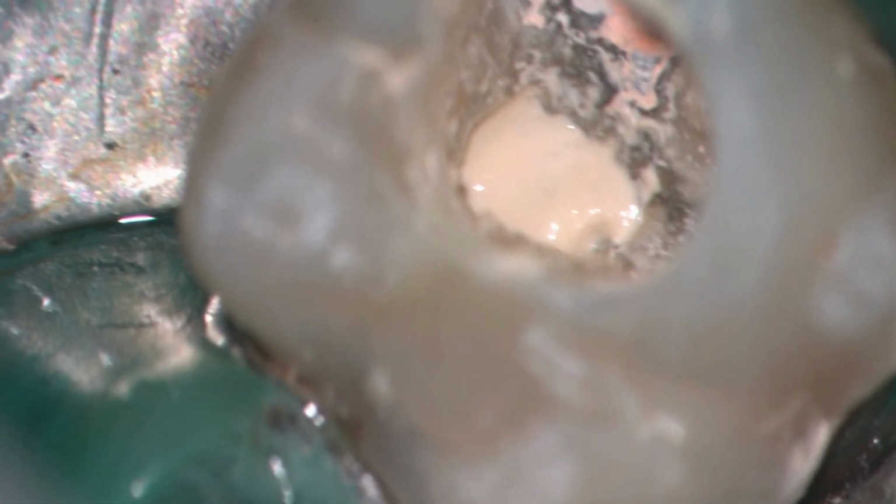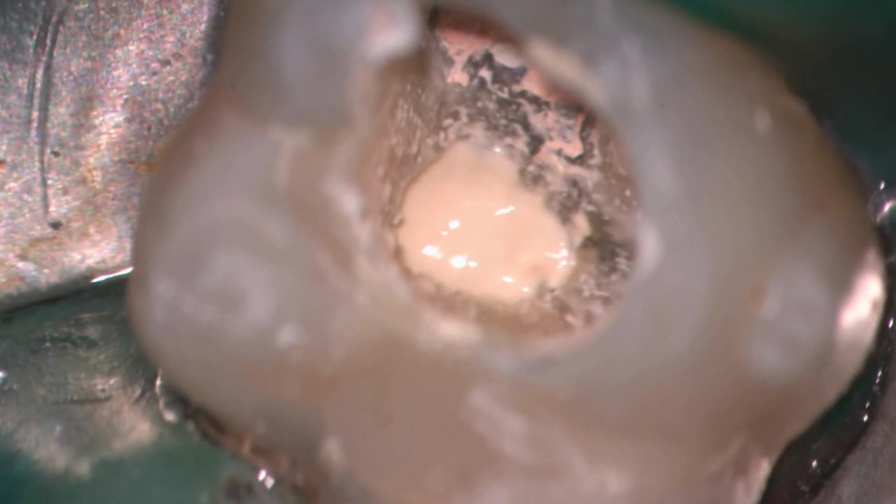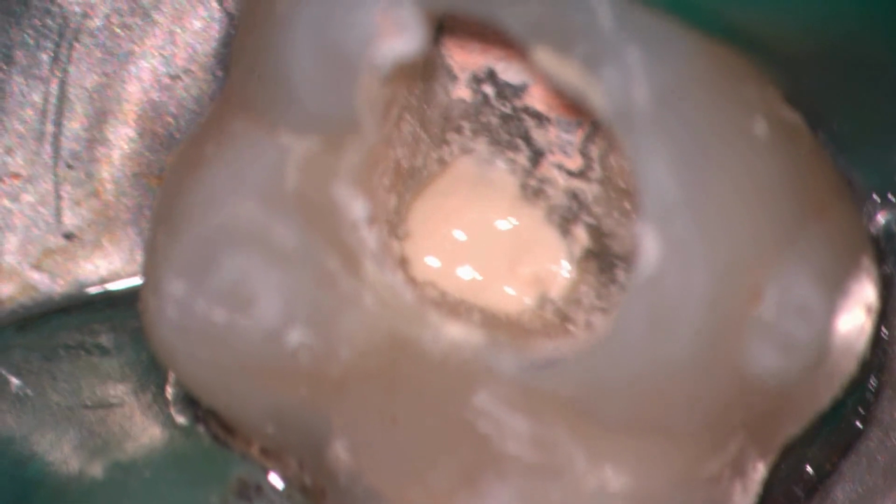In this instance, we still have a very thin layer of the Cavit that was placed externally at the first visit, and so that kind of contains the Biodentine so it won't express grossly out the external defect. Now the next thing I'll do is have my assistant place a ball of Cavit on a 12 plugger and pack that over the Biodentine, compressing it down.